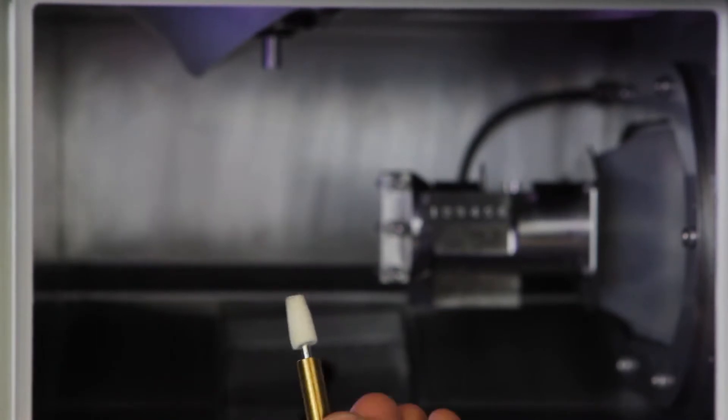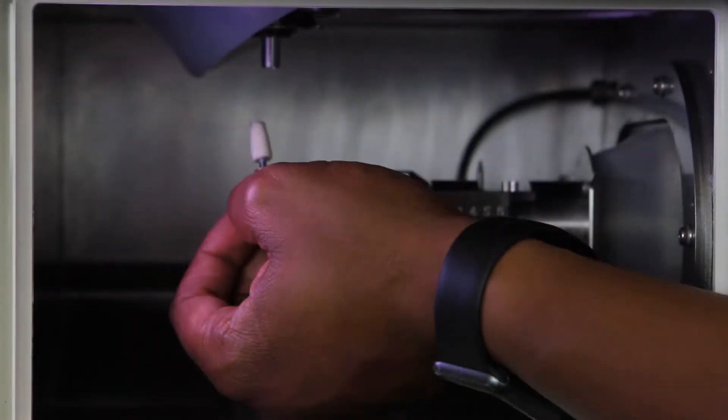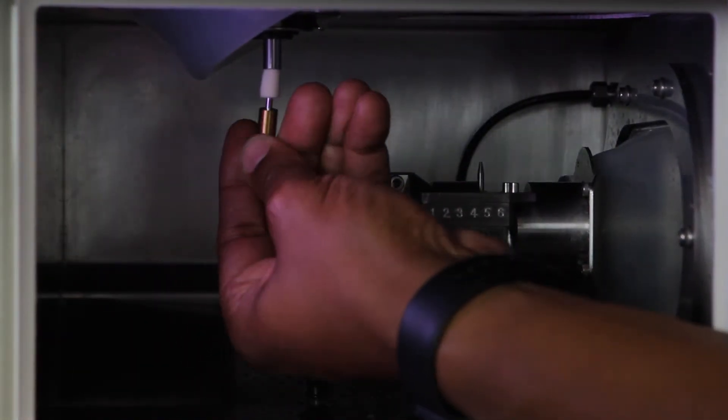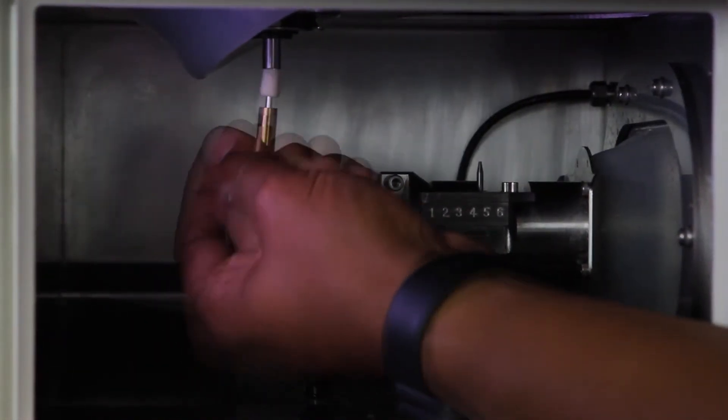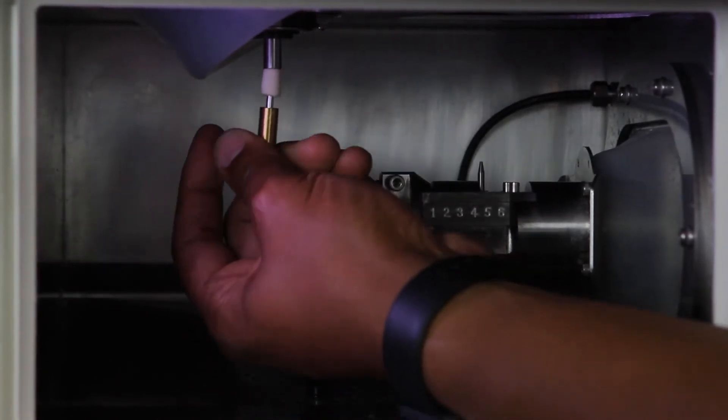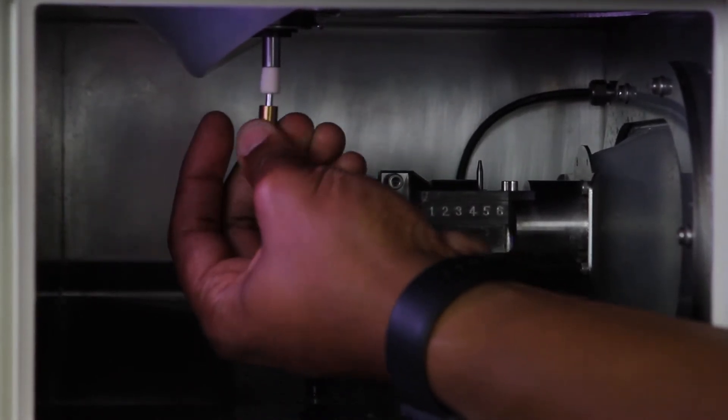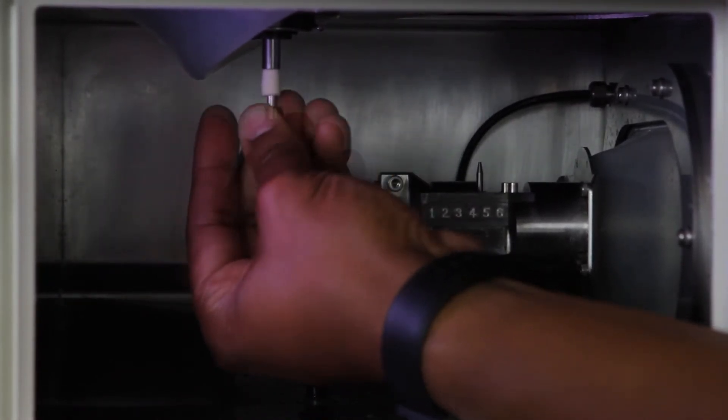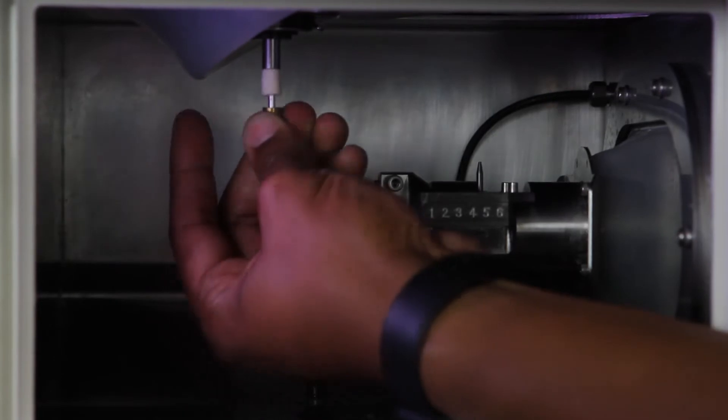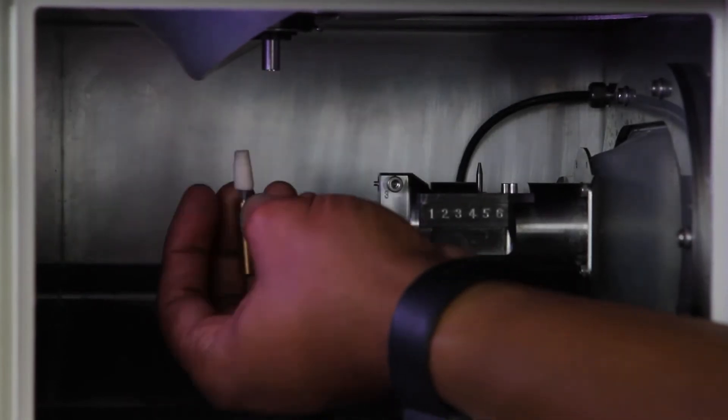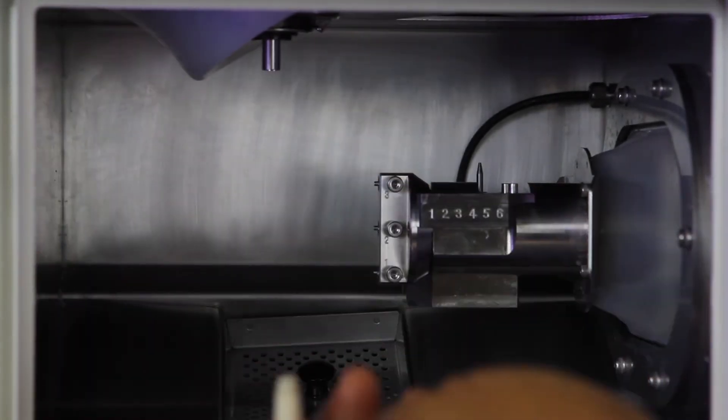Grab the taper cleaner and insert it into the spindle head. Push the taper cleaner firmly inside the spindle head to avoid dropping it inside the mill. Twist the taper cleaner left to right to clean out milling waste from the spindle head.